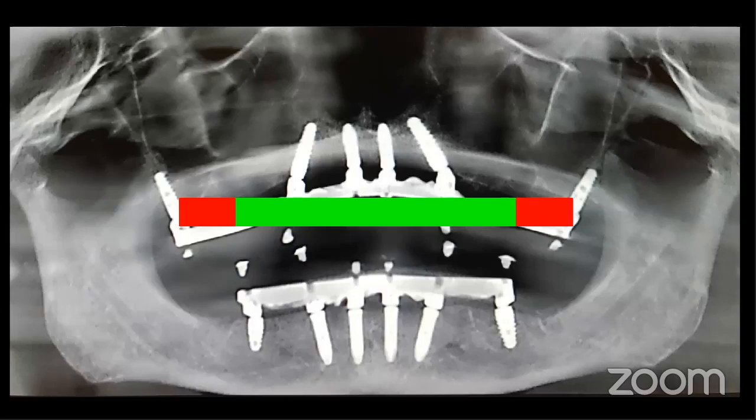And some patients, I can tell you that when you put their teeth in, they almost forget how to smile. When you ask them to smile, they literally smile with all of their might. You could see the tendons in their neck flexing. It's crazy, but it's almost every patient. They just smile so big because they're finally happy to have some teeth again. And if it's somebody that has a very mobile lip, you're going to see that area. And unless you're going to do a lip repositioning surgery, that's going to cause you a problem. And pterygoid implants can eliminate that problem.